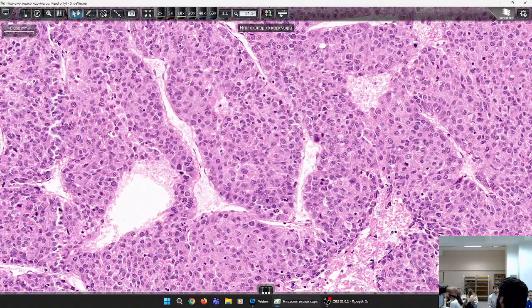And there are mixed cases. This is how we explain the fact that there are mixed cases of the same tumor containing a compartment with hepatocellular differentiation and another with cholangiocarcinoma. We'll see the cholangiocarcinoma now. So it can be zone 3 and zone 1 at the same time? Yes, it could be anywhere because it comes from stem cells, not from differentiated hepatocytes.